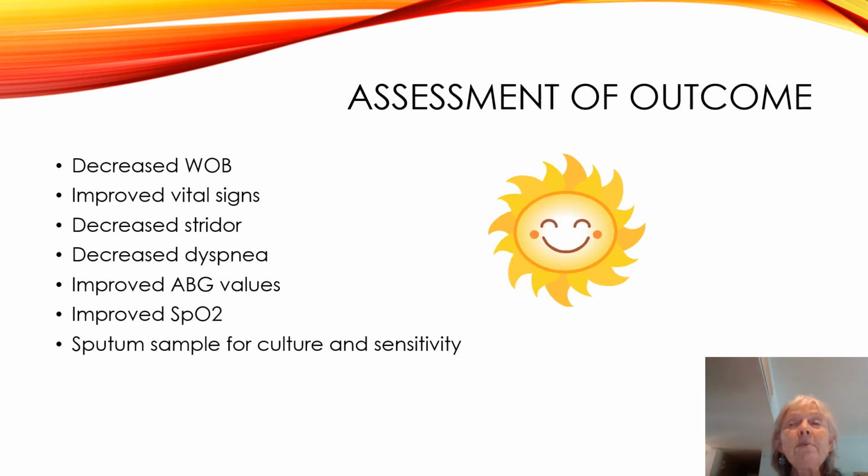And we can ask them at the end of this treatment, how do you feel? And a lot of your patients are very honest with you. I feel so much better. These treatments work out really well for me. I'm glad that you came here so I know what's going on with it. If we have to do an ABG, I should see a better PaO2. I should see a decrease in my CO2, and hopefully my pH will stay within its normal acid-base balance. If I'm doing pulse oximetry, I want to make sure my SpO2 is much better also for this patient.